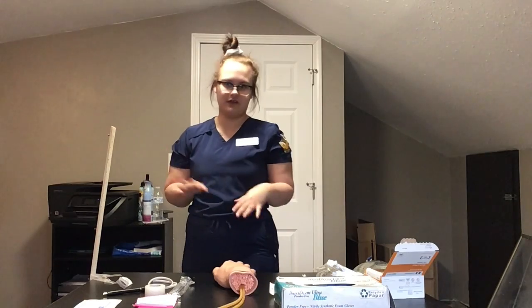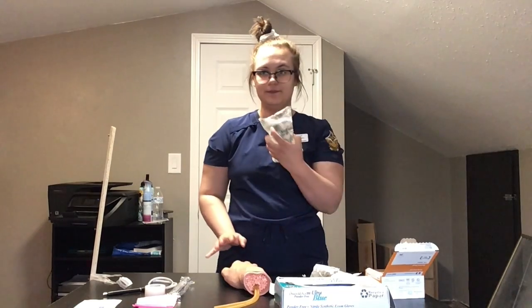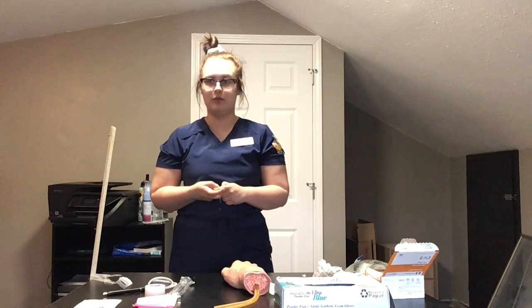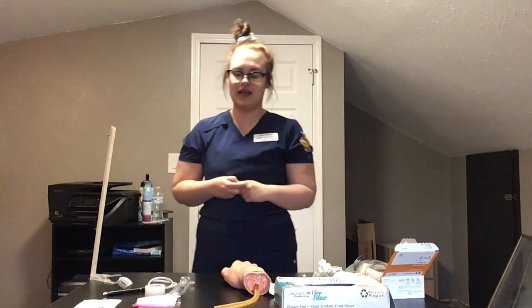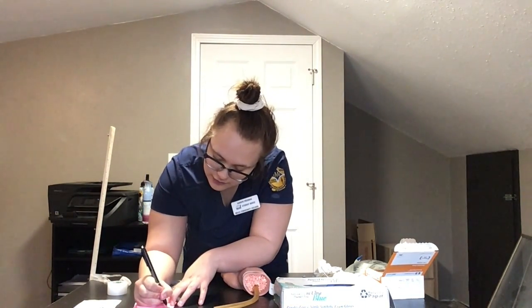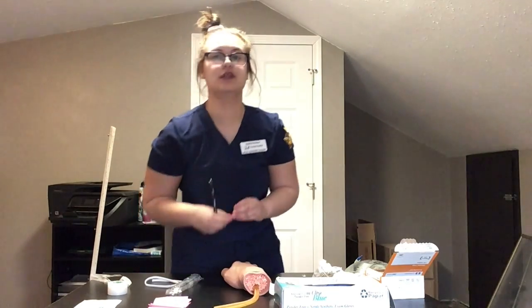So after I've checked that, I get my IV tubing, and then I'm going to label my IV solution. They didn't give us labels this year, so I'm going to be using sticky notes. For the labels for the IV solution, I would have my initials, the patient's name, and today's date. And then I would put that on the IV solution bag.